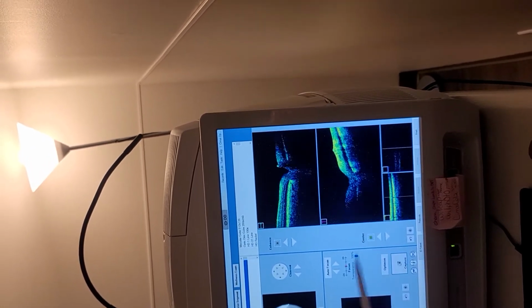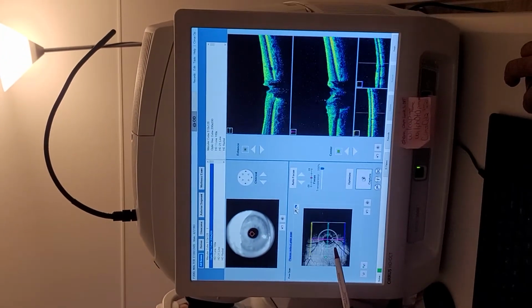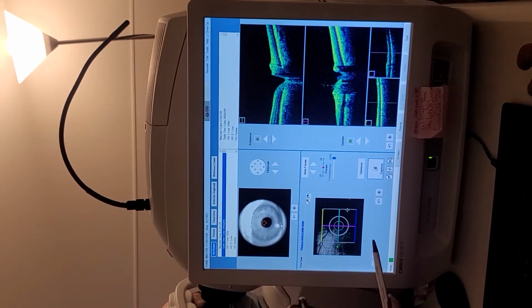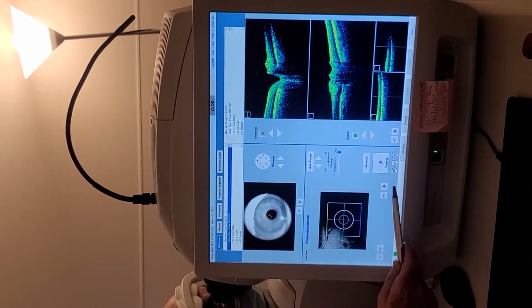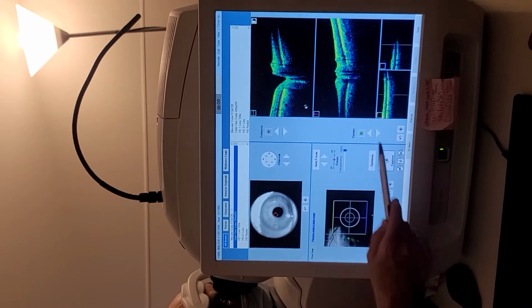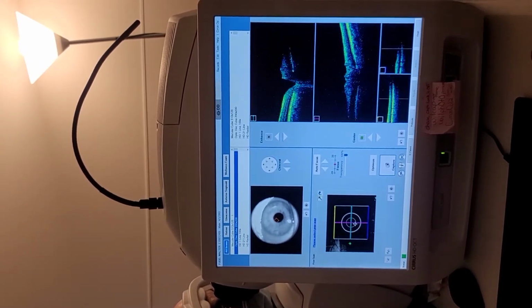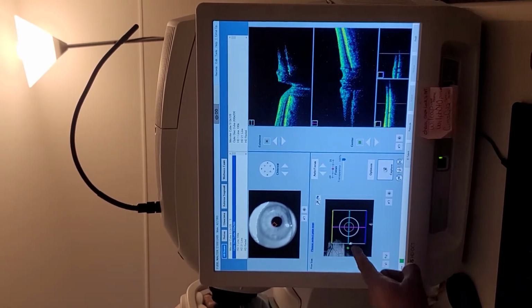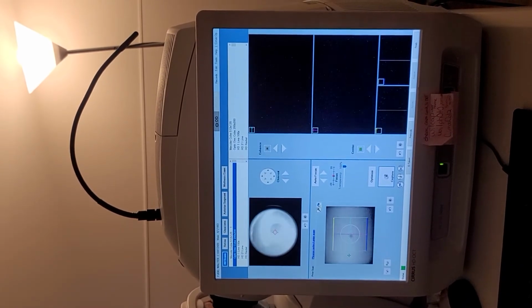Look over here, and that will tell you where it is. And then over here, and he's moving. He's a mover and an eye shaker too, right? Do not move so fast. Okay. Looks nice. That's okay, you can fix it on the next screen, so take it, because you got it in the center. You are moving your eye so fast. It's fine. Tell him to autofocus. Blink, blink. Okay, look at the green star.